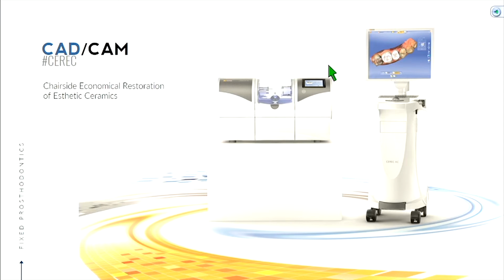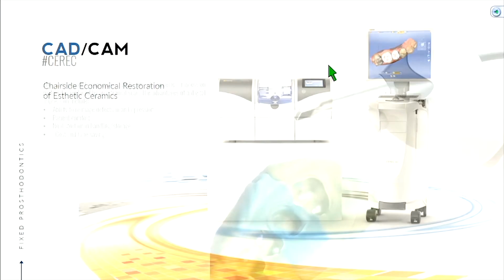So with the advent of a lot of this technology, they're able to automate a lot of this stuff and use a different method of fabricating a crown. And with that came a difference in materials as well, which we'll talk about. So with the advent of higher strength ceramics, we're able to ditch the metal coping PFM idea and have something that's all ceramic.